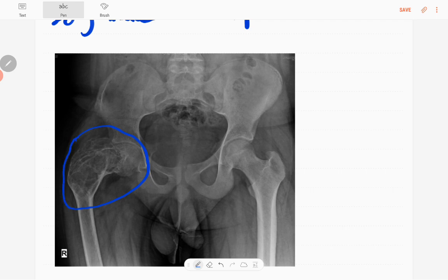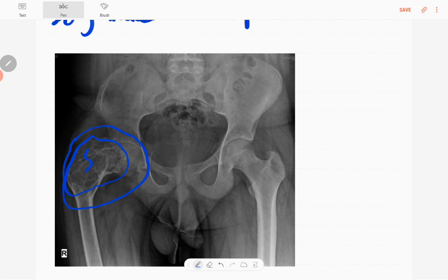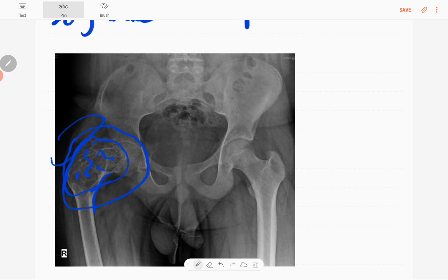There's a geographic type of lytic lesion in the right upper femur metaphysis. It's an expansile lesion. You can see lobulated areas looking like multiple loculations, with endosteal scalloping. There's no definite cortical breach in this region, no soft tissue component, no periosteal reactions. It has a narrow zone of transition.